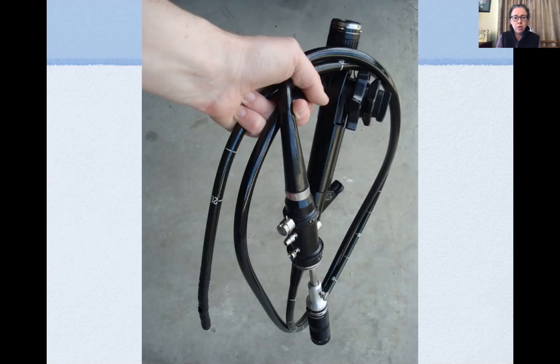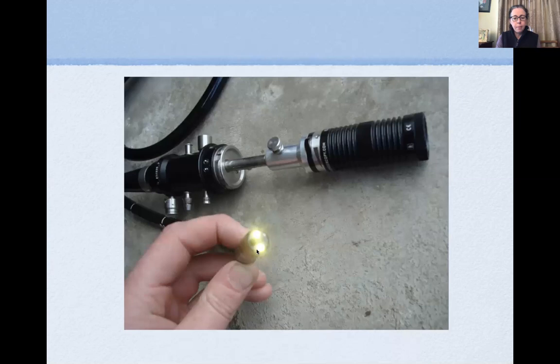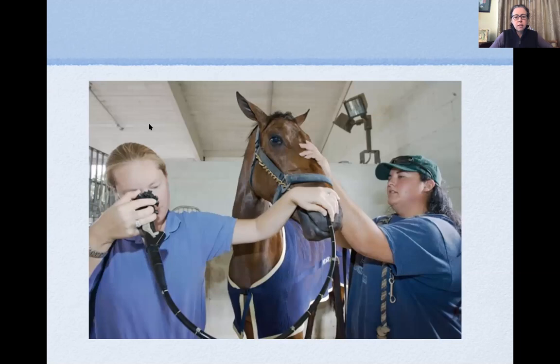The knobs on the endoscope control the tip — you can steer up, down, left, and right to visualize the area you want. At the free end of the tube there are two light-emitting ports, a camera port, and an opening through which you can pass biopsy brushes or lavage tubes to take samples of liquid from the airway or infuse something in — that's the biopsy channel. The procedure is shown here on a racehorse having its upper airway examined, with the animal wearing a head collar and lead rope.